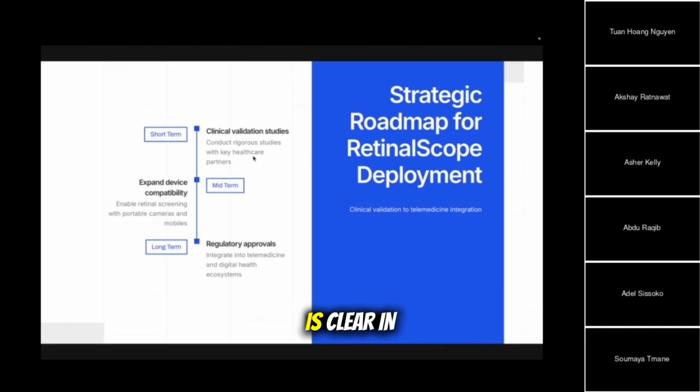So our roadmap is clear. In the short term, we are working on clinical validation studies. In the midterm, we aim to expand to portable fundus camera devices and internet-less devices, so people can use the app offline without needing to access a certain website, which would make it even less resource-intensive and more accessible to people.